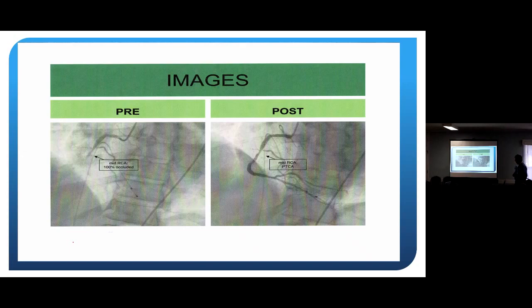So this is that guy's cath report pre and post. So he had a right coronary that was jacked up, as you can see here. They go in, balloon it out, and now you got great perfusion.